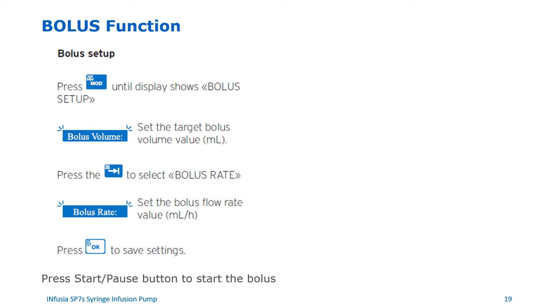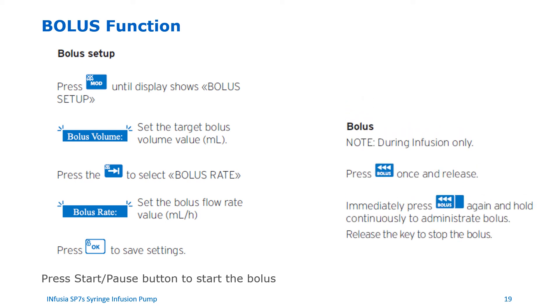Bolus function. To set up and program a bolus dose, press the MOD button until bolus setup shows up. Set the target bolus volume to be infused in mls. Then press the switch button to select bolus rate, and set up the bolus flow rate value in mls per hour. Then press the OK button to save settings. Then press the start pause button to start the bolus. You can also deliver a bolus dose while running an infusion: press the bolus button once and release, then press the bolus button once again immediately and hold it continuously to administer a bolus dose. When done, simply release the bolus button to stop the bolus.